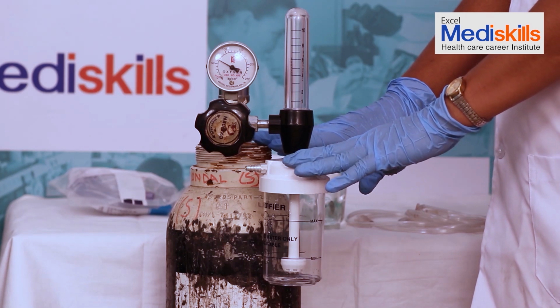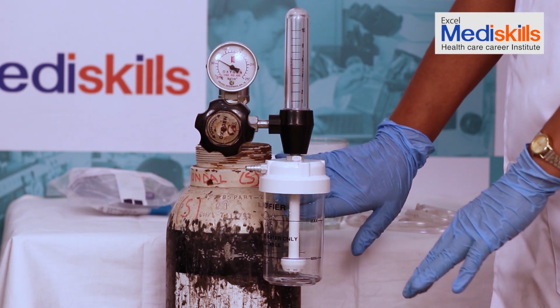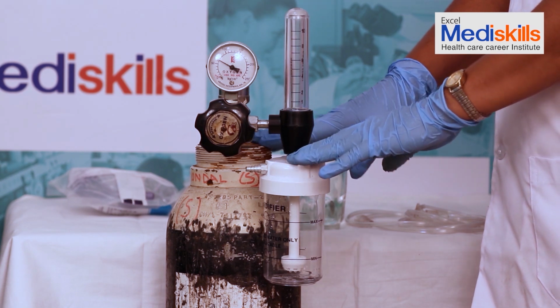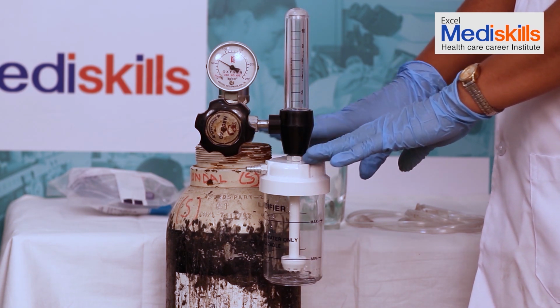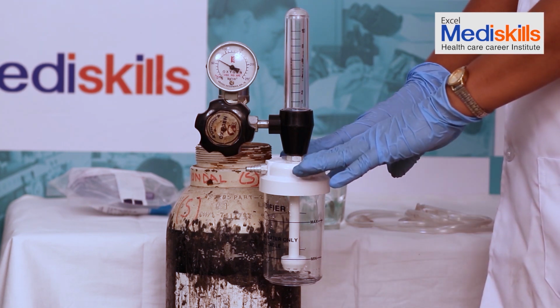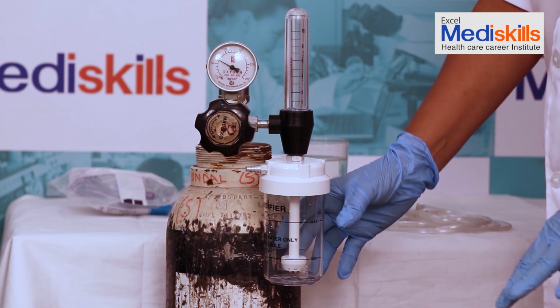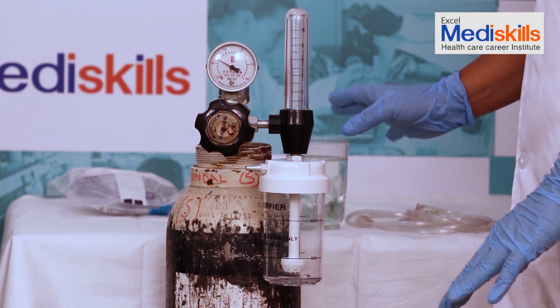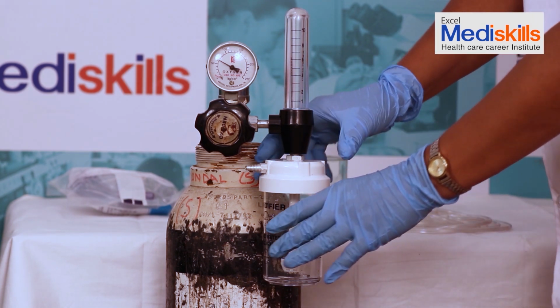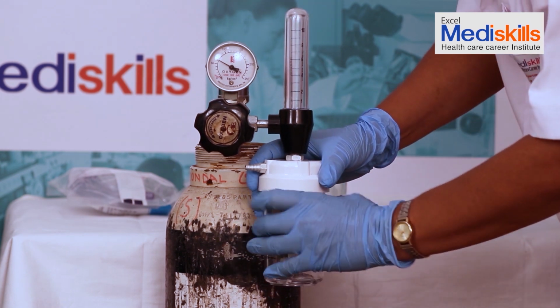We generally give oxygen to a patient from a cylinder. The oxygen that is present in these cylinders is dry. We do not give dry oxygen to a patient because that makes their throat dry. So we use water from the humidifying chamber to humidify the oxygen. For that, firstly, we have to fill the humidifying chamber with water. We now open the chamber carefully.